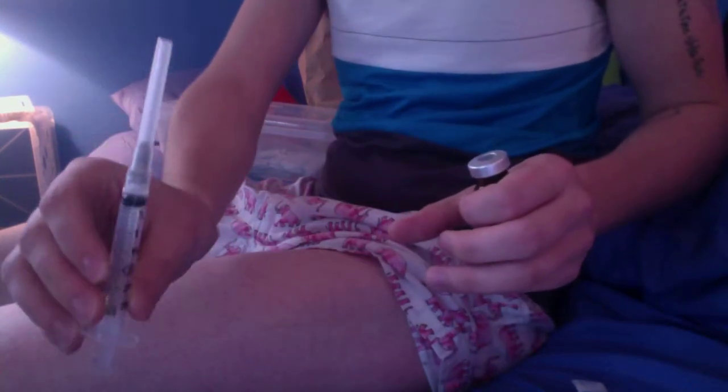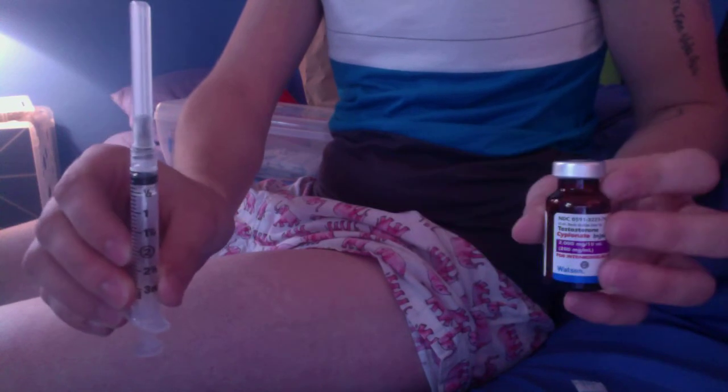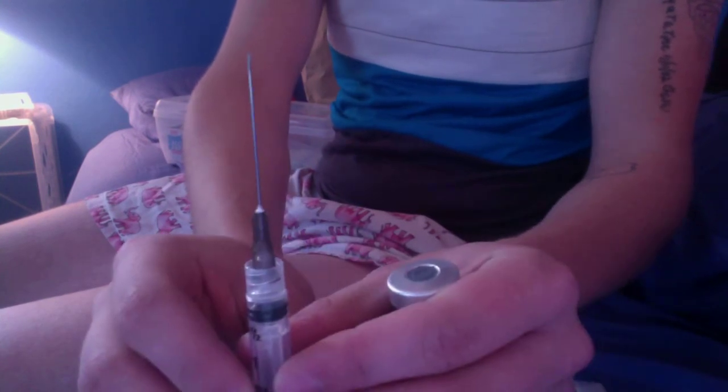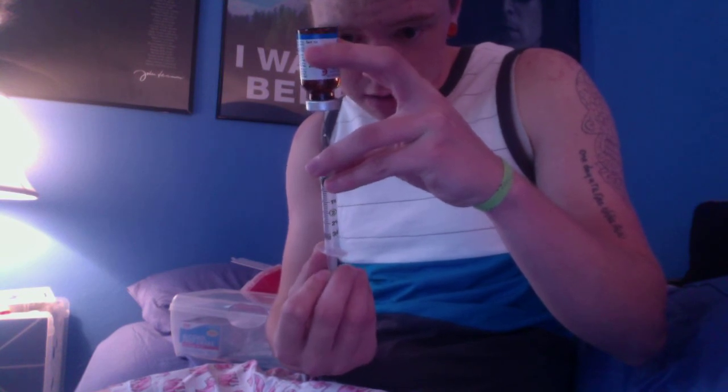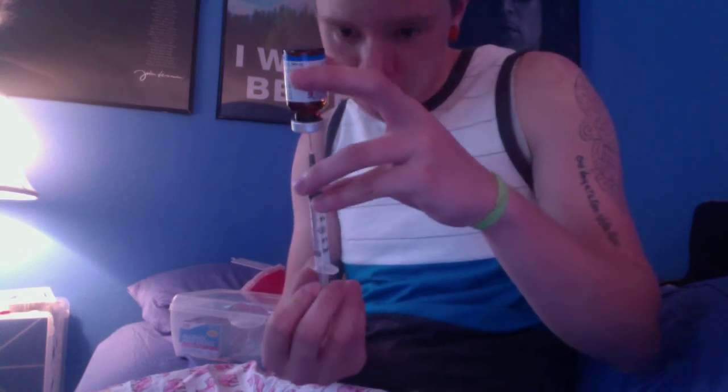Open up your syringe here. I use 200 milligrams per milliliter, and I do half a cc every week. Take this off and set it somewhere where you're not going to lose it. This is the thickness of the needle — this is what I also injected with for a few weeks and it hurt like a bitch. So, stab that in there. Testosterone is a very thick liquid, so I'm going to pull back very slowly. This actually takes the longest amount of time — for me anyway — to get the testosterone out.